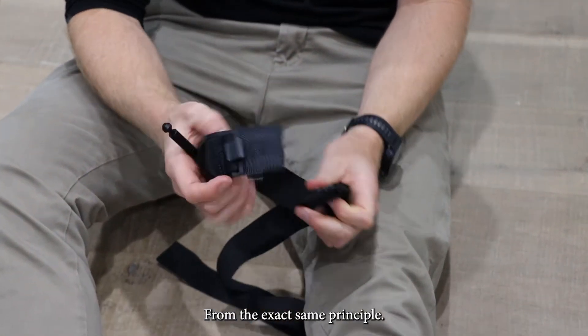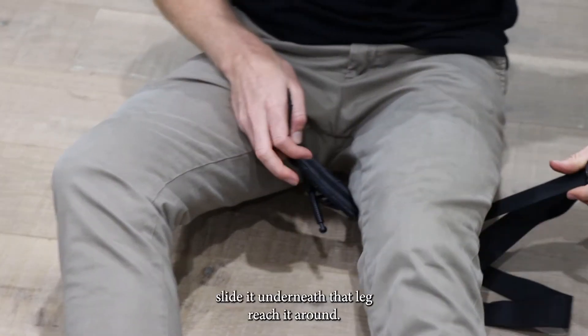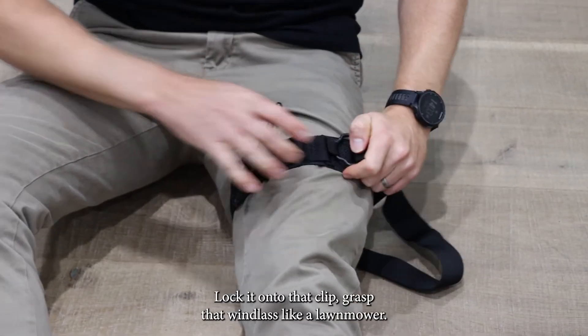From there, the exact same principle: pressure bar or the base of that material facing uppermost. Slide it underneath that leg, reach it around, and lock it onto that clip.